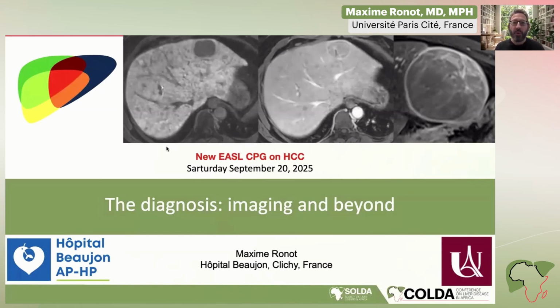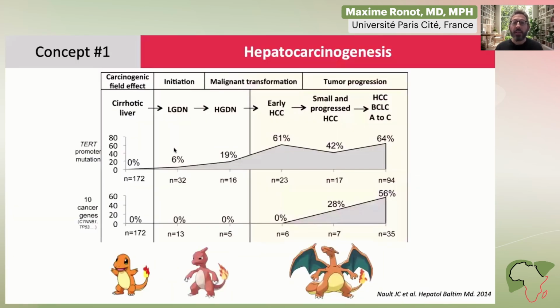My name is Maxime Ronot from Paris, France, and I will be talking about the diagnosis of HCC, about imaging, and beyond that. Now, to understand the context of what I'm going to talk about, we need to remember that HCC is the end stage of a very progressive transforming process that turns regenerative nodules into malignant tumors over different steps of progressive malignant transformation.